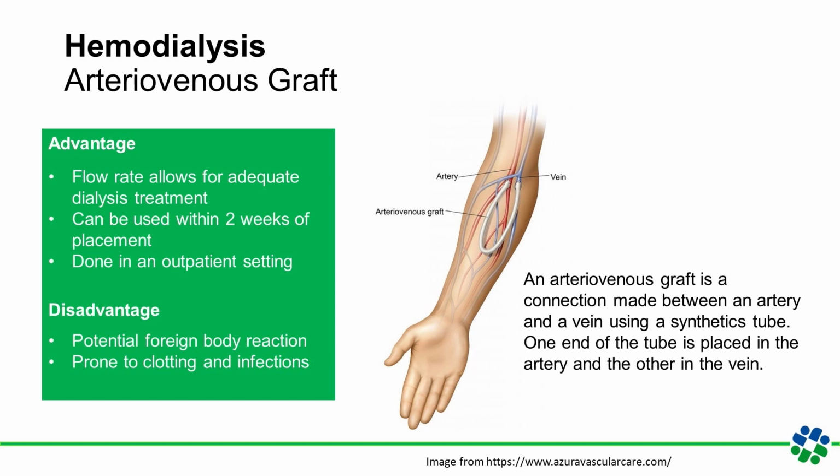Another exciting technology is the Fraxis Intergraft, which introduces the concept of an endovascular anastomosis to maintain the openness of an AV graft, particularly at the graft-vein connection. This technique shows promise in reducing the incidence of graft failure, which often occurs at that critical junction. By employing minimally invasive procedures to reinforce the connection and optimize the flow, Fraxis Intergraft holds potential to extend the lifespan of an AV graft and minimize the need for frequent intervention and replacements.